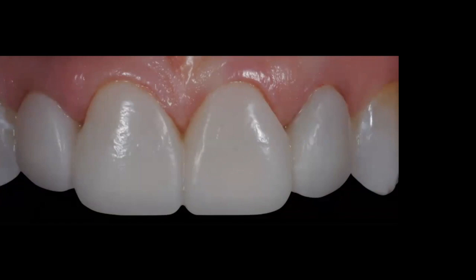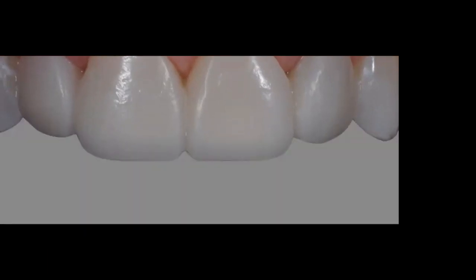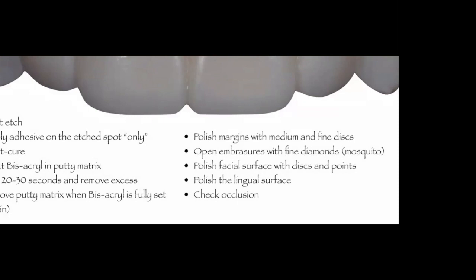Wait 20 to 30 seconds, remove the excess through the vents, then wait a full two minutes for the bisacryl to fully set. Remove the putty matrix — now your temporaries are bonded to the teeth and never come out. Then with a mosquito bur, open the embrasures just enough for the patient to use a soft pick and clean around that area. In this case because there are interproximal preparations, the temporaries are physically locked in place and will need to be broken at delivery day.